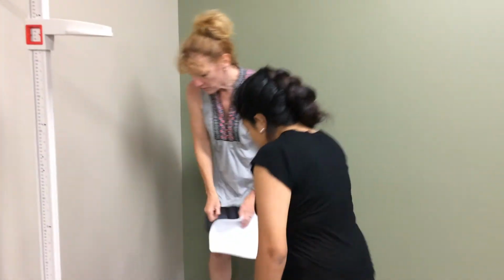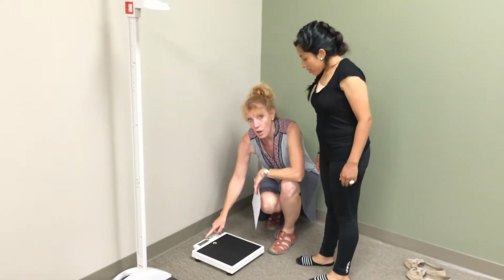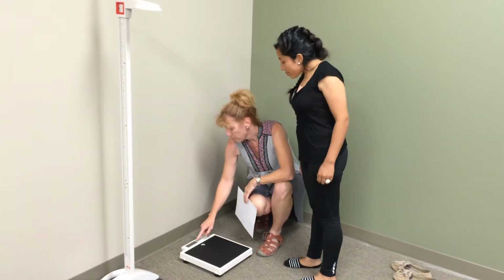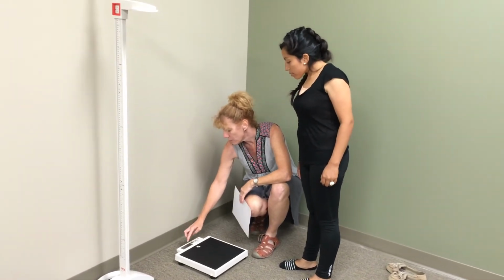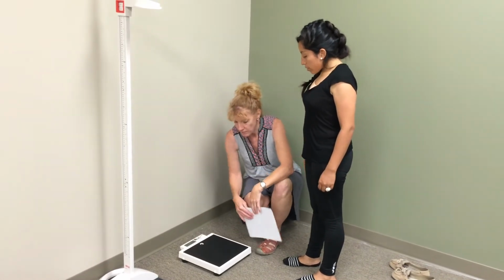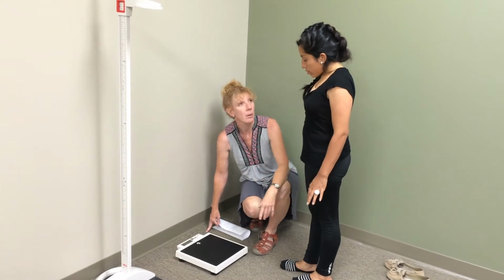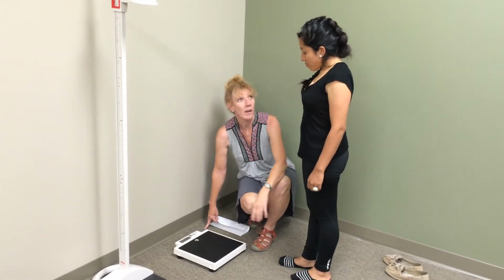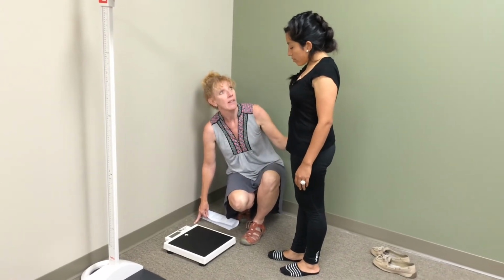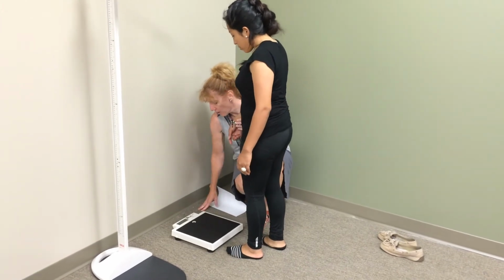So then you come over to the scale. The scale automatically shuts off, so you put a little bit of pressure on the scale and it will turn on. It should say 0.0 kilograms. We measure in kilograms. Then you make sure the child doesn't have rocks in their pockets and isn't hanging onto toys, and take off their jacket and all that. So you just want them in light clothing, and then you ask them to step up on the scale. Oops, hold on, it shut off.